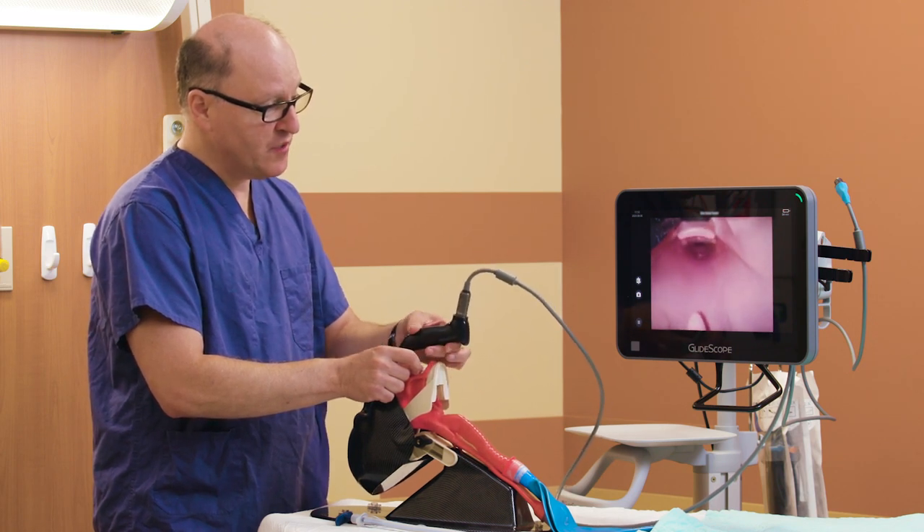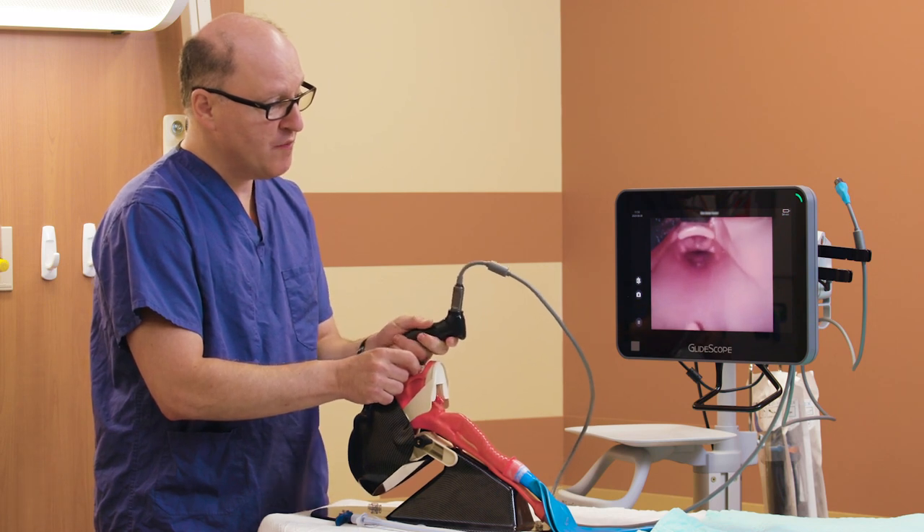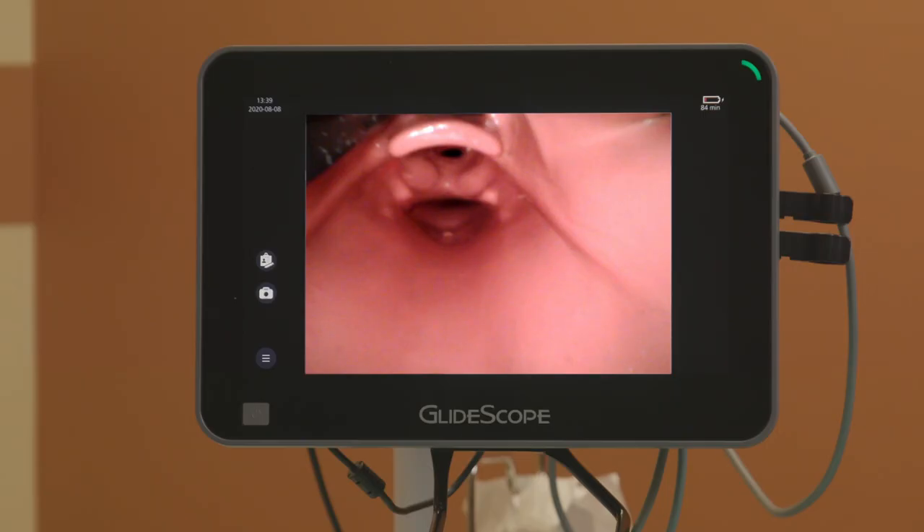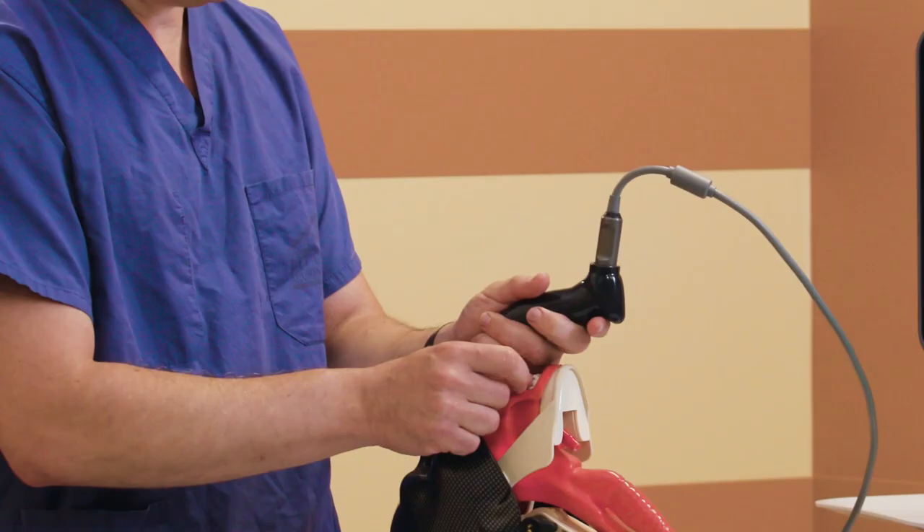At this point, I can switch my grip, which gives me more mechanical advantage on the laryngoscope blade, but I do not want to over-insert. I want to make sure that the lower half of the screen is free for tube delivery. So the target, the larynx, is in the upper half of the screen, but the entire lower half of the screen is going to assist us with tube delivery.